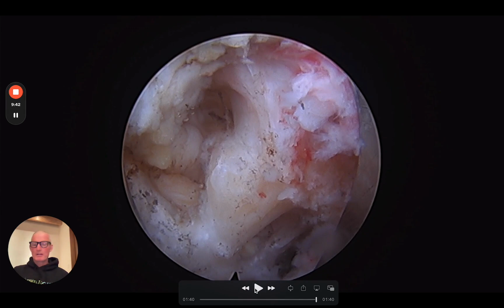So the summary here is that this is an extremely effective procedure. I personally have been able to achieve significant pain relief in patients who met very good inclusion criteria for medial branch transection. The clinical vignette that I commonly see is that the patient will have 2 or 3 percutaneous radiofrequency ablations with shorter and shorter intervals of pain relief. They're then referred to me by a pain management colleague, and in situations like this where I can identify and divide the nerve, I'm usually able to achieve a significant degree of pain relief and clinical success.